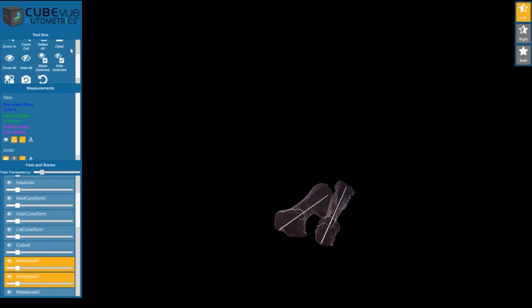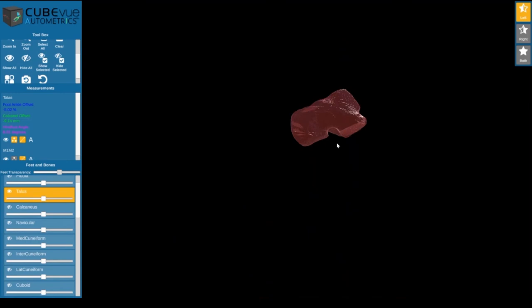You can also get a 360-degree view of any bone, including the bone surface and joint spaces.